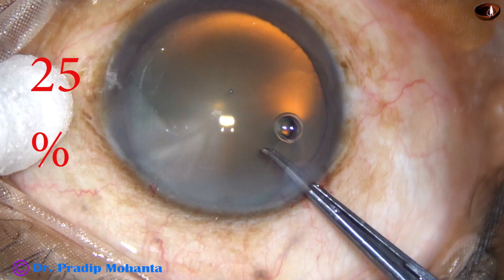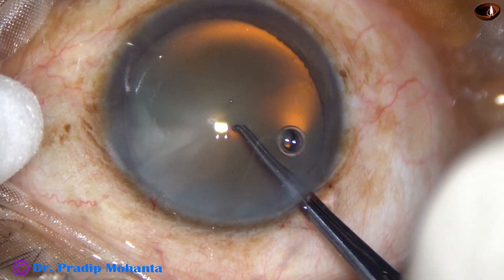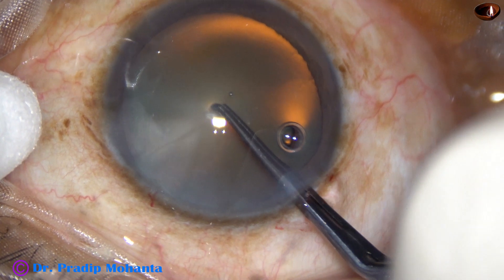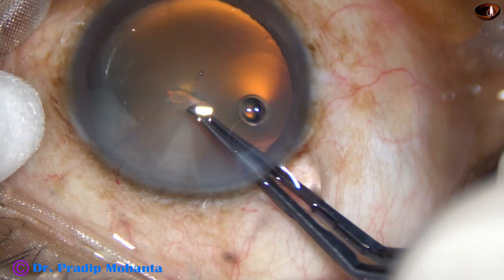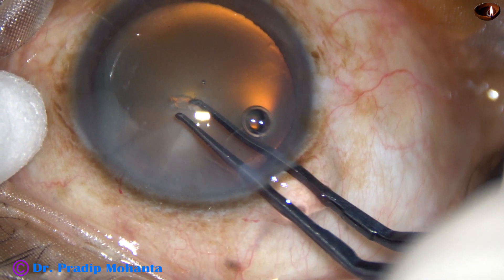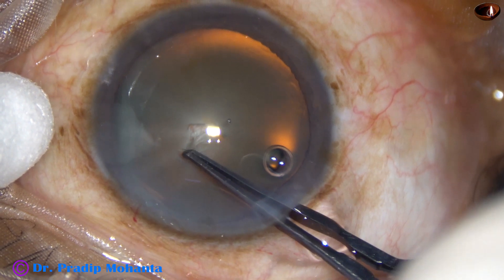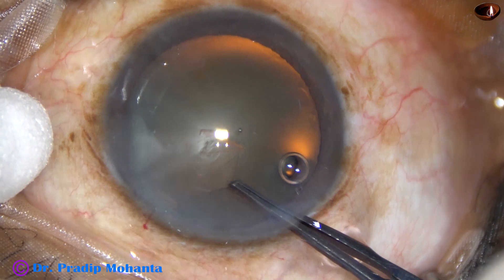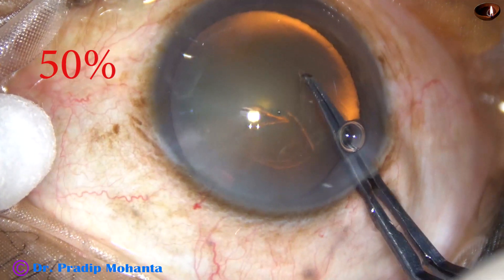The pointer is introduced, the arms are closed, and it pierces the anterior pole of the cataractous lens. A capsular tag is raised, the capsular tag is held, and now we go to 50% speed.